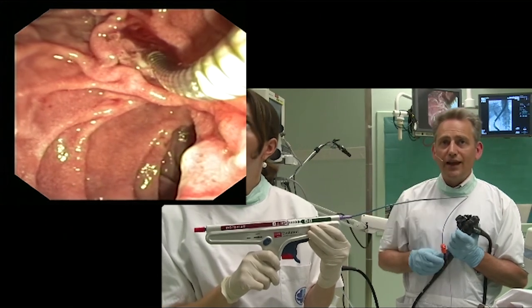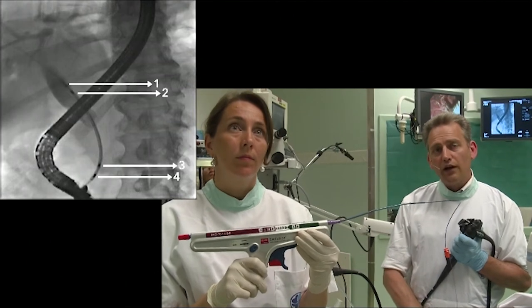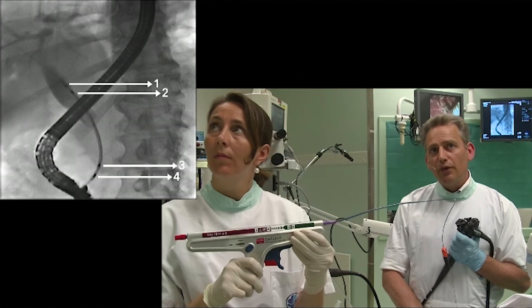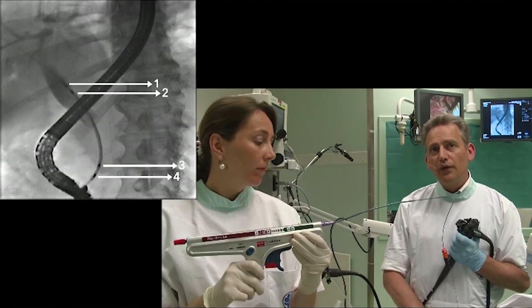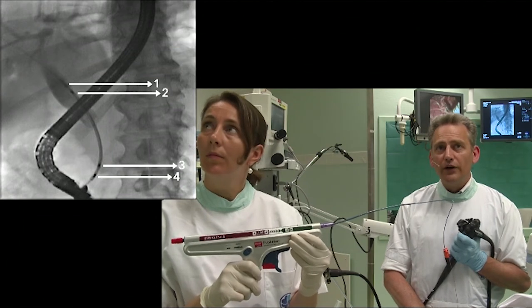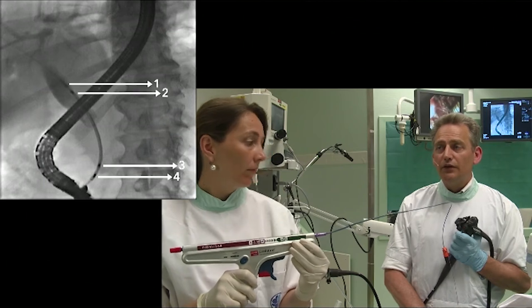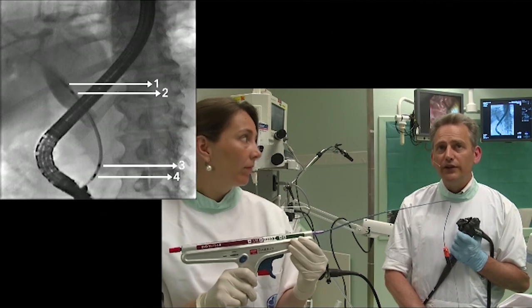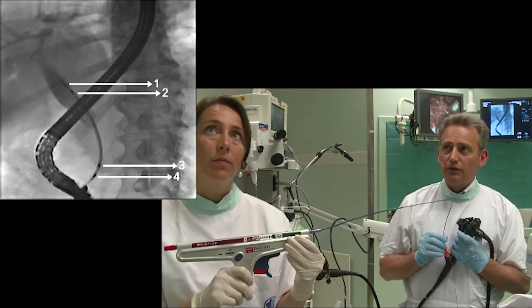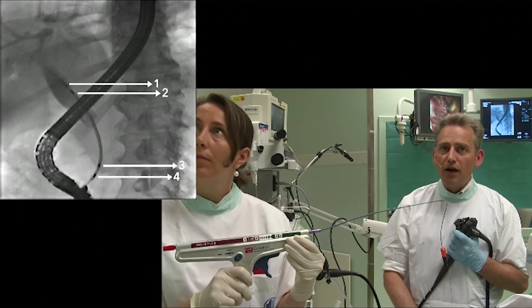And also if we look on the fluoroscopic image, we can see 4 radiopaque markers. We see 2 radiopaque markers above the scope in the proximal portion of the common bile duct. One is the proximal extent of the stent while it's deployed. The second marker we will see will retract while we deploy the stent, and then distally we have 2 more markers.